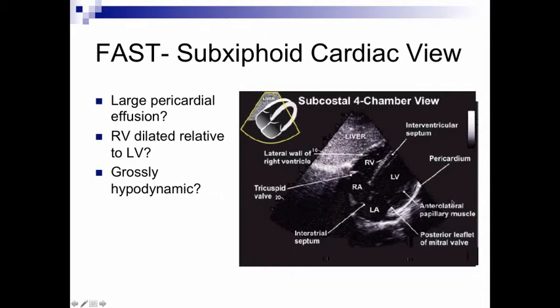And if you were doing it in the context of a cardiac echocardiography, the apex would be pointed the opposite way. But the superior to inferior orientation of structures on the screen, with the right ventricle and right atrium at the top, will be the same, and left ventricle, left atrium below will be the same.